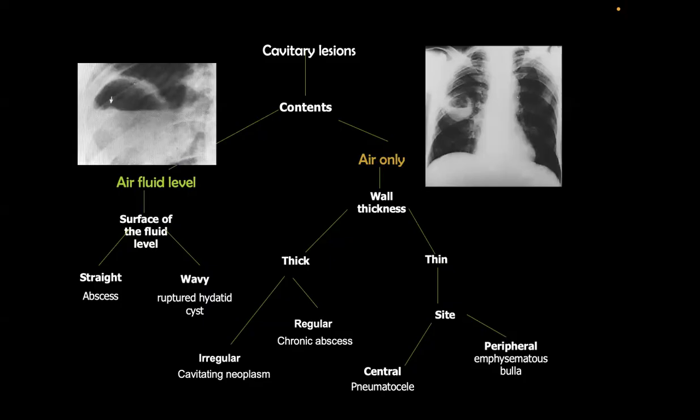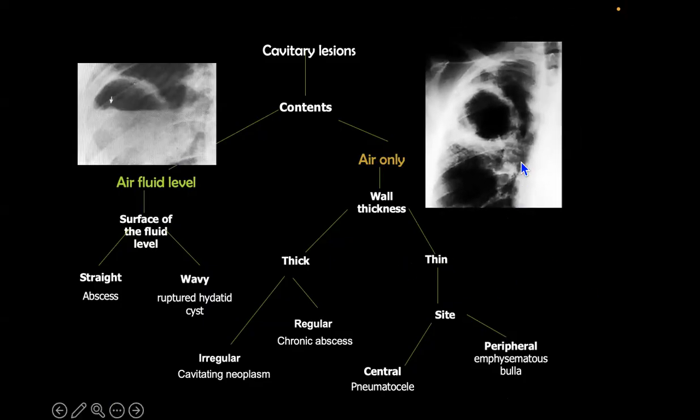As I said before, before making any interpretation of a chest radiograph, you go back to the history, and the history, of course, guides us to the diagnosis. And you are the ones providing us with the history, so it must be quite different from that of malignancy or that of hydatid cyst.